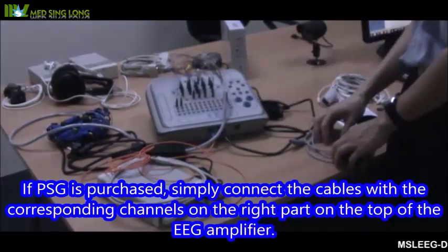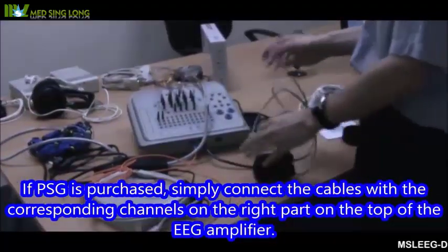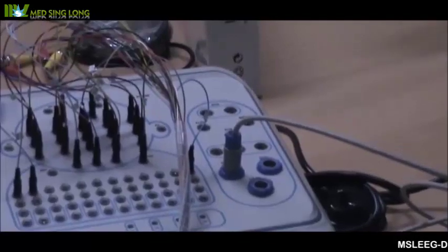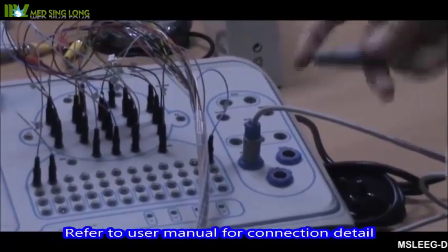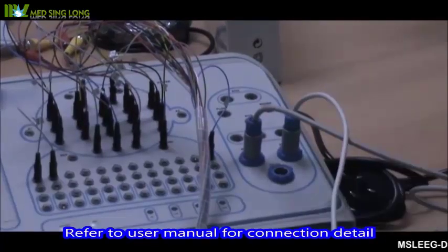If PSG is purchased, simply connect the cables with the corresponding channels on the right part on the top of the EEG amplifier. Refer to user manual for connection detail.